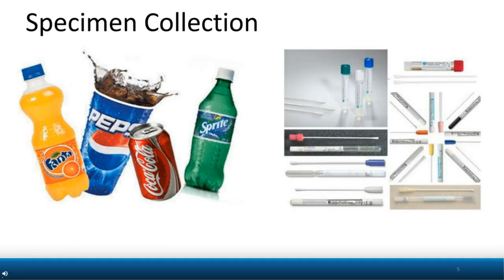And the same thing can be said for swabs and collection media. There's lots of different types of swabs and many different types of collection media, and as we know with soda, all swabs and all collection media are not created equal.